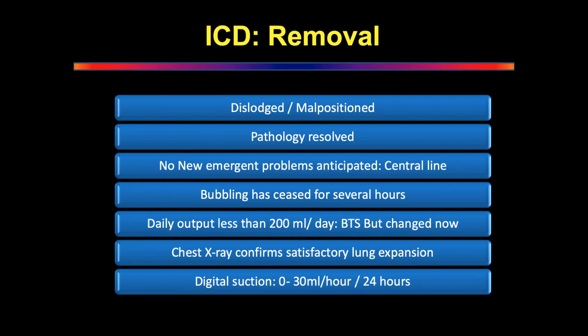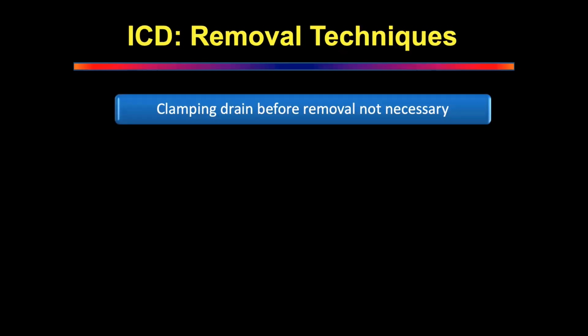We'll talk about it. My first point there is that clamping should not be done, it's not necessary. You don't really need to clamp. In fact, it is discouraged. We say that as surgeons, you should not clamp a drain before removing it.